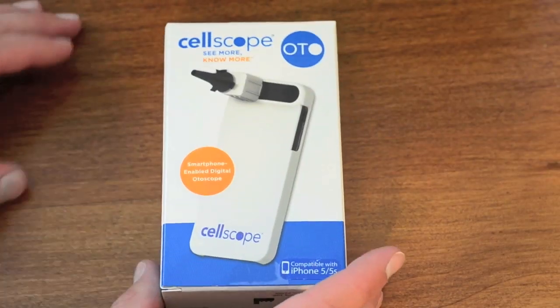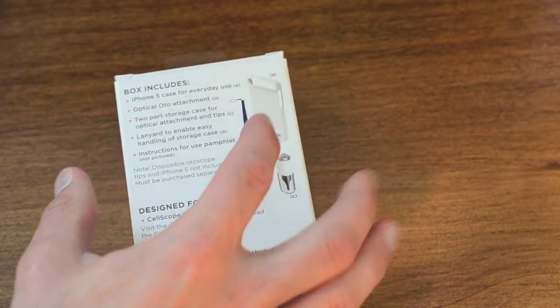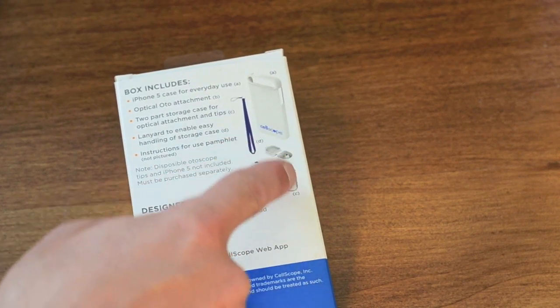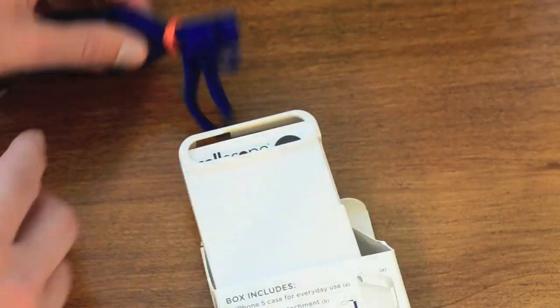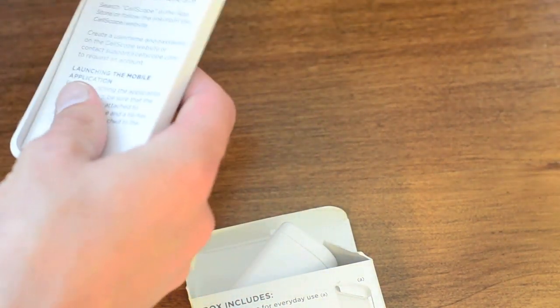I'd like to unbox this thing and give you guys a quick demonstration and show you what it's like. Here's the box, here's what's included: the case, a lanyard, the actual scope, and a storage case. Here's the lanyard, and here's the actual phone case itself.